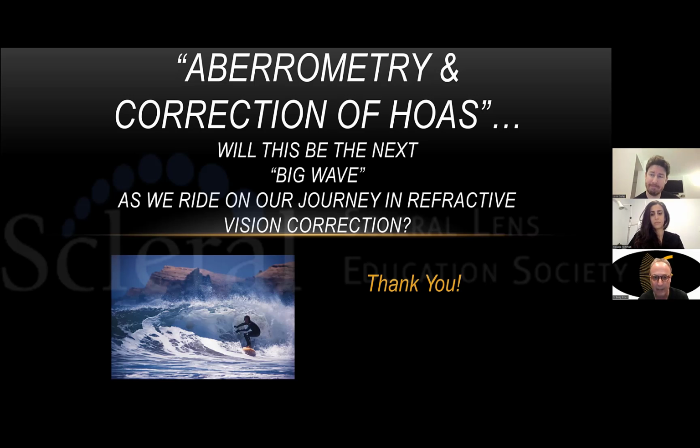And sometimes because of the position of the visual axis, even the ability to offset the optics appropriately, and again, in a customized way, is going to help. Because if you have offset optics, you're going to even induce certain high order aberrations that may not be part of the patient's visual system, but now part of the lens patient visual system. Would you like to comment, John?